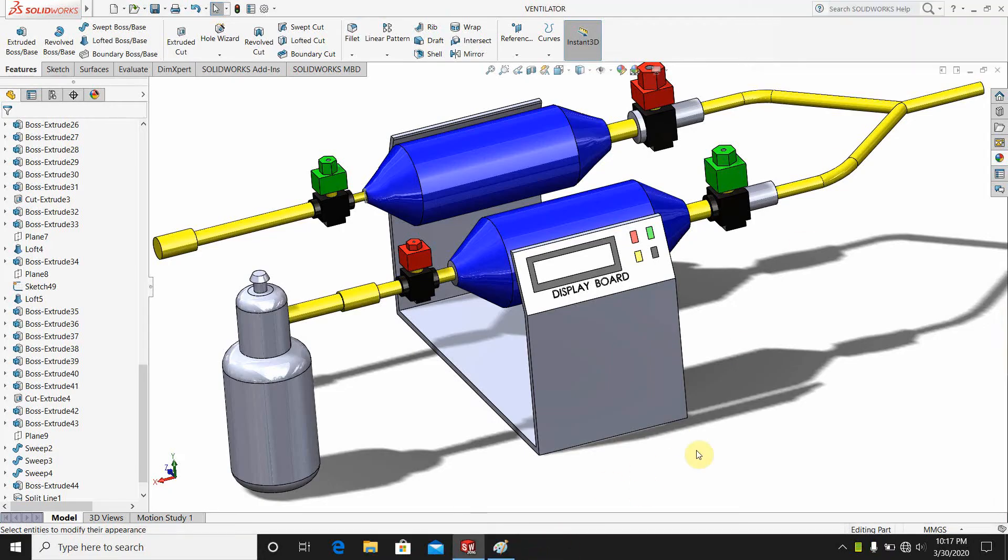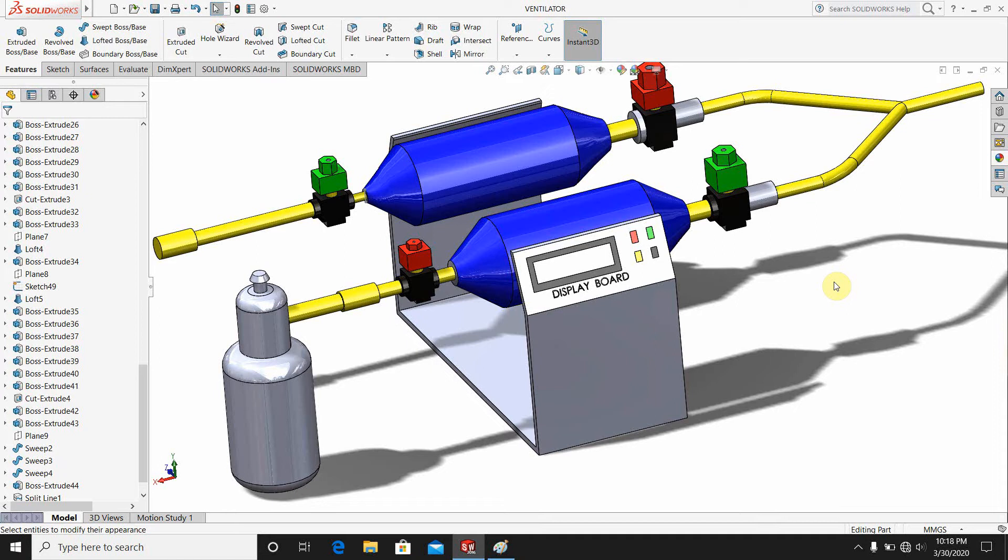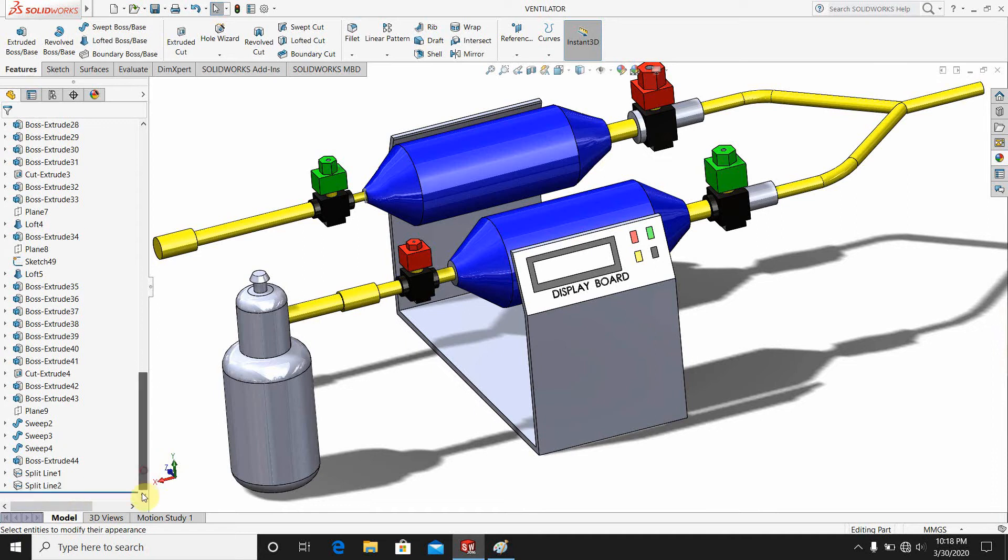Hello guys, here I am going to design a medical ventilator and this is the drawing of the ventilator. Now I am going to show how to design the medical ventilator in the CAD software. Here is the design. So at first, let me show you how I draw the design.